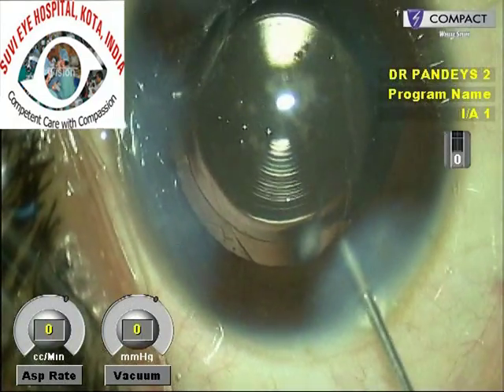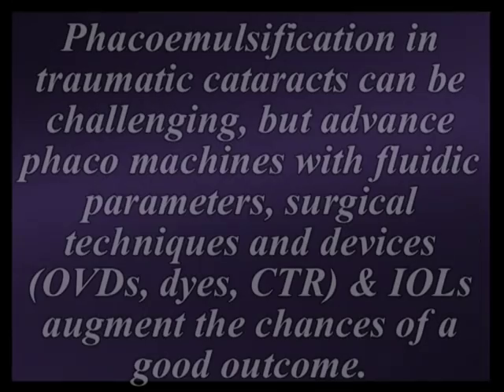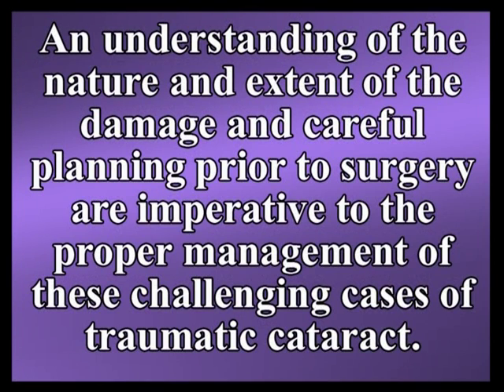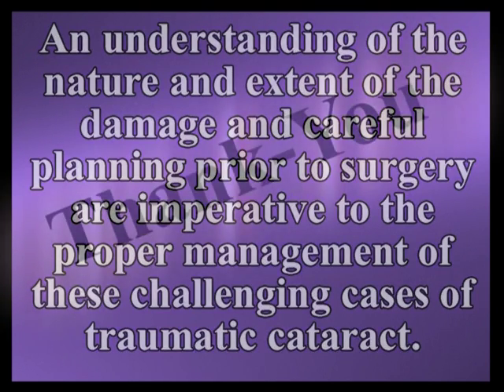We injected intracameral moxifloxacin into the anterior chamber, which is possibly even more important in traumatic cases. To conclude: cataract management in traumatic cataracts can be challenging, but with the availability of advanced phaco machines with good fluidics and devices such as viscoelastics, dyes, capsule tension rings, and different kinds of IOLs, good results can be provided. We must plan the surgery well and anticipate any additional maneuvers that may be needed during the surgery.